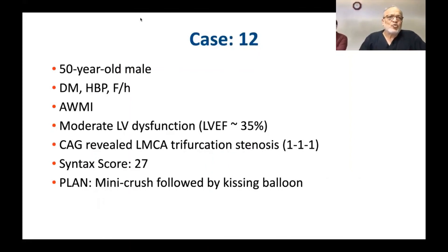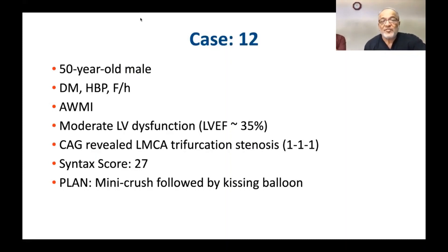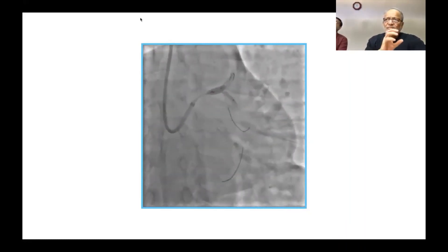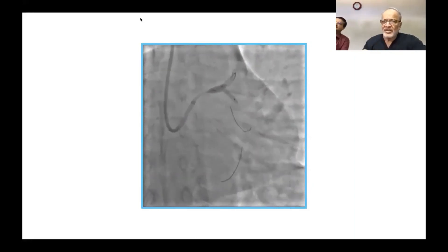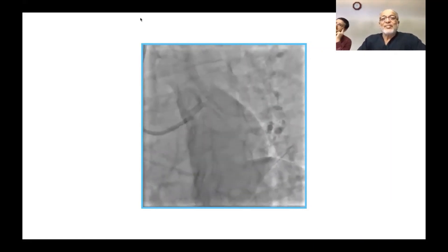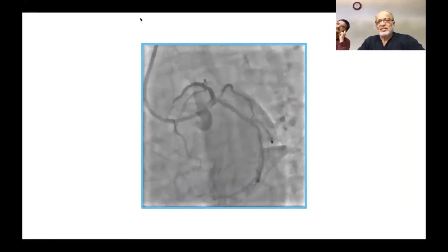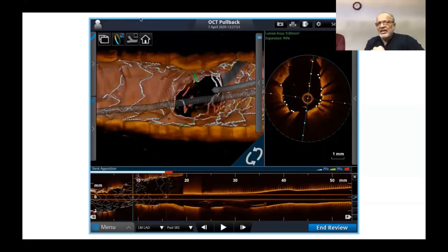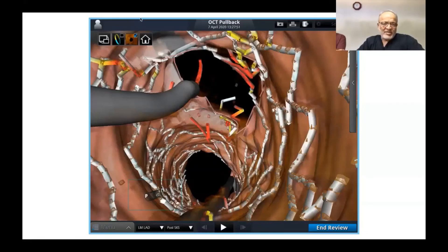A 50-year-old gentleman with anterior wall MI, diabetes, hypertension, family history, LV dysfunction, LMCA trifurcation, syntax score 27 — mini crush followed by kissing balloon was planned. In trifurcation situations we do not bother much about the ramus if it is small or moderate in size; only if large would we use three wires with extensive instrumentation — ultimately the goal is to revascularize the major part of the coronary system. Because it was an ongoing anterior wall MI we did not insist on distal crossing. Final OCT check showed proximal crossing and link-connecting carina, as seen in the fly-through view.